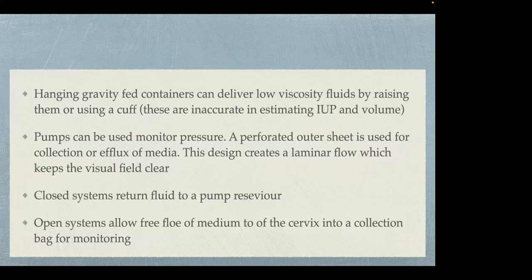In our cases, I don't think we are actually using an open system. We allow the water to leak. And unfortunately, when we do our hysteroscopy, we have towels put by our feet to absorb the fluid. And this is inaccurate in assessing the amount of fluid, or the deficit of fluid, that we actually have.